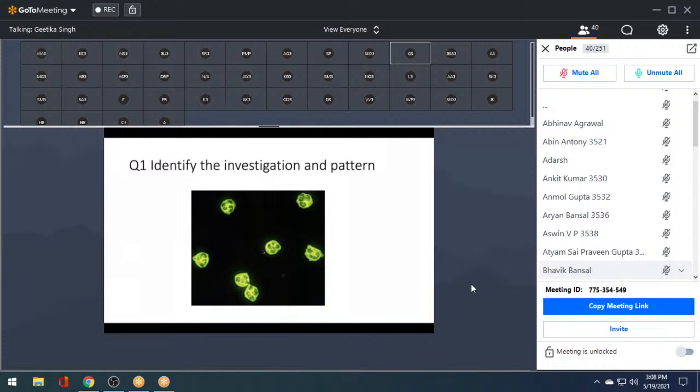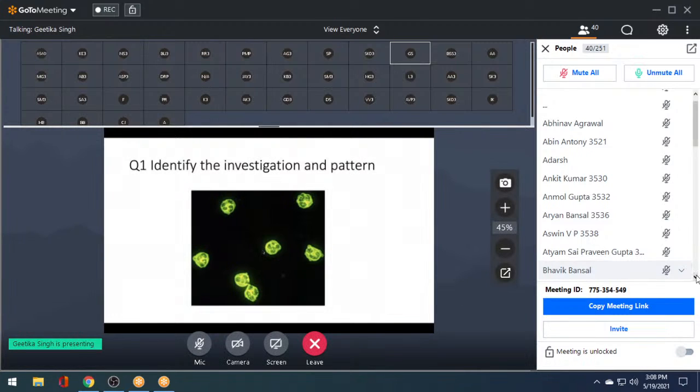Direct immunofluorescence is what you see when you examine kidney tissue. So this is indirect immunofluorescence. You are correct. This patient's serum has been put on a slide which has neutrophils on it, and this patient has ANCA. It is C ANCA. Is it typical or atypical C ANCA? Can you describe it?